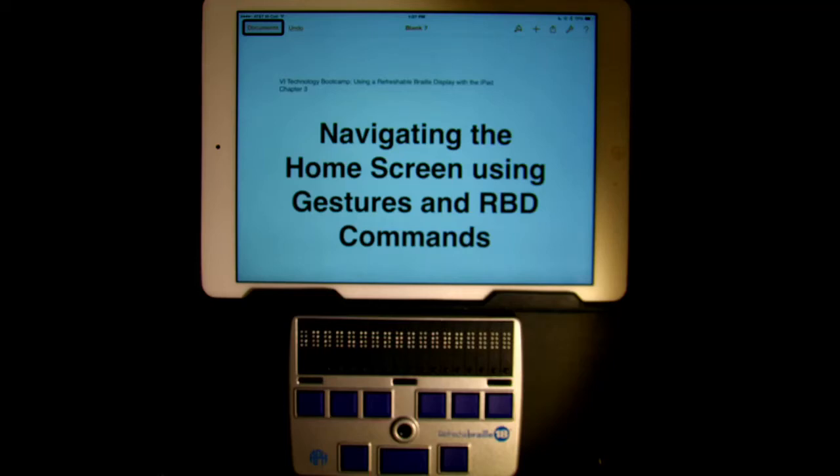This video demonstrates how to navigate the home screen using gestures and refreshable Braille display commands.